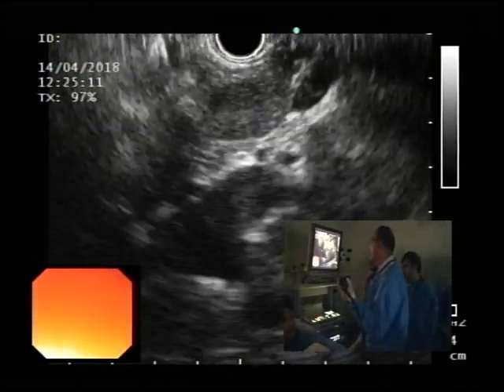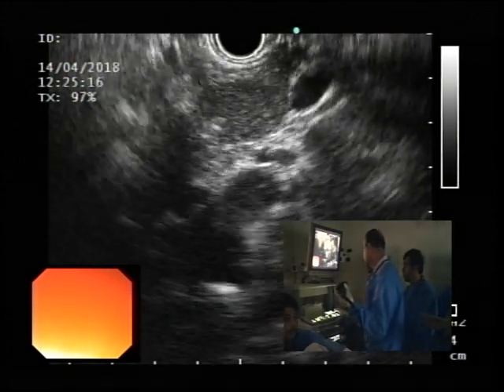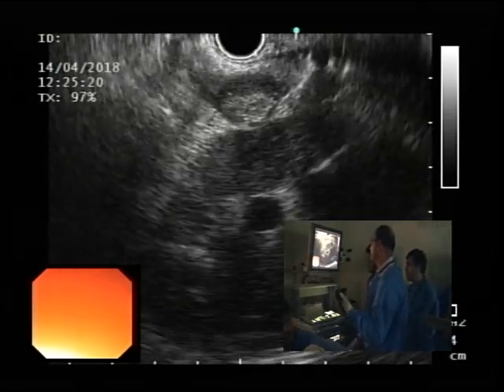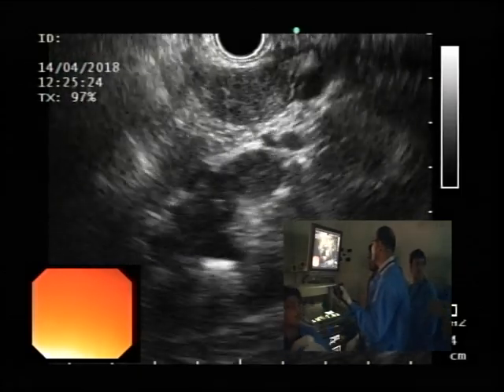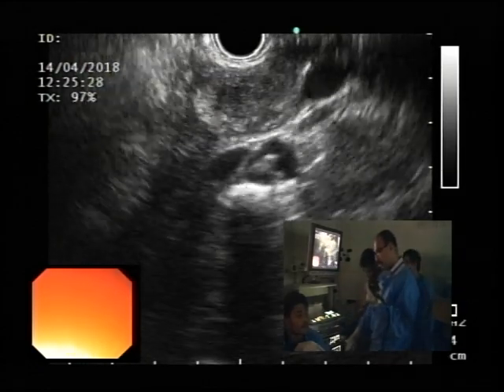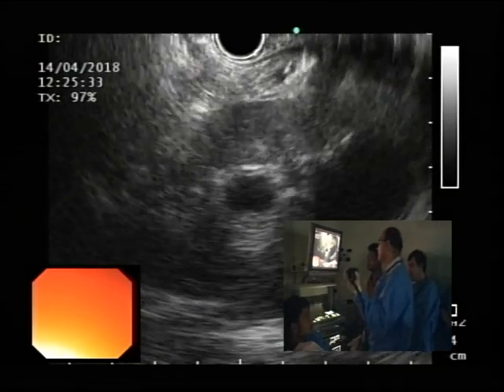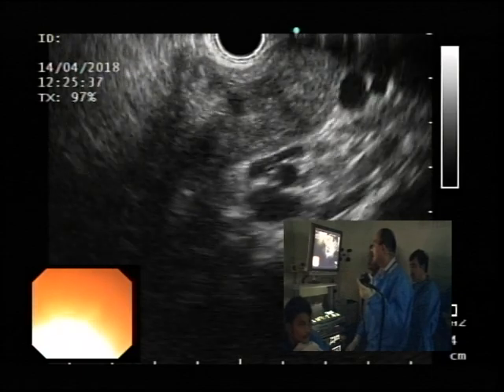This is the pancreas. Here, it's hard for me to differentiate pancreatic changes from a true mass lesion, partly because of the abnormalities, partly because of our scope equipment. But anyhow, we're following it towards the tail. Again, I'm not sure if you can see my hands, but clockwise going to the patient's left, वहाँ पे ख़त्म हो रहा है, and then as I go counter we are seeing pancreas.